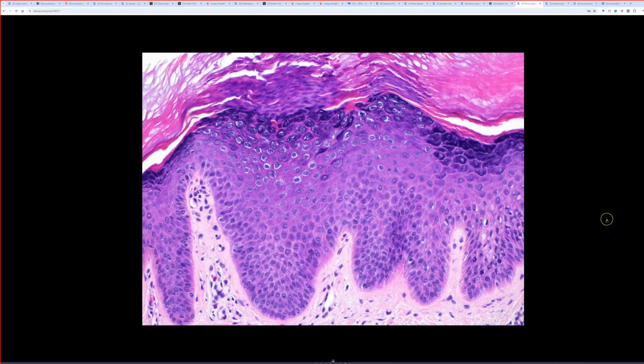And sometimes when you scratch or pick the skin, you get something called lichen simplex chronicus or prurigo nodularis. And it can also have some overlap. It can get kind of vacuolated, slightly enlarged keratinocytes, slight undulation, hypergranulosis. So sometimes I have trouble actually telling them apart. When you've got good bird's eye cells like this, no problem. It's going to be a Verruca plana.